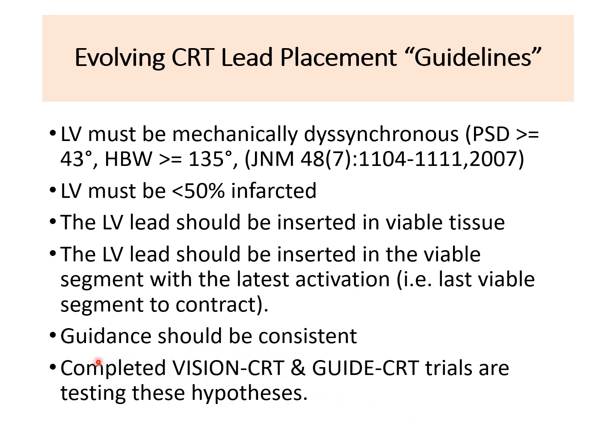One supported by the IAEA, called Vision CRT, and one finished in China called Guide CRT. And both these trials are testing the tools that I just mentioned.